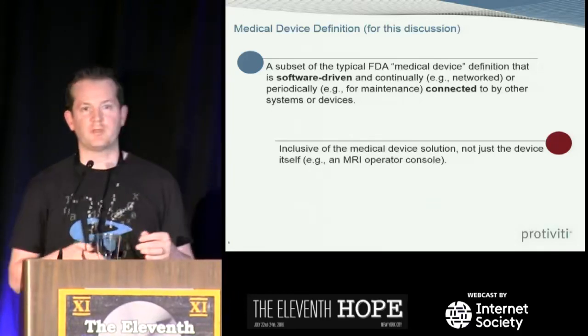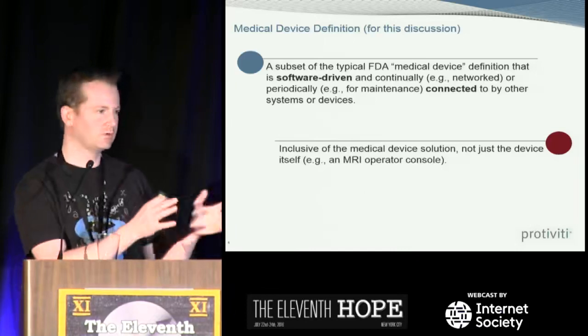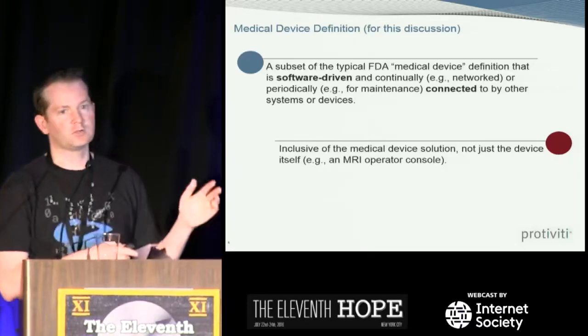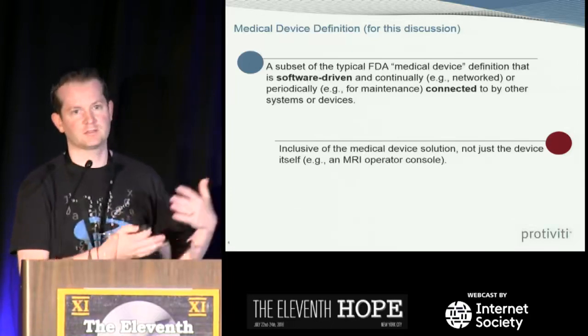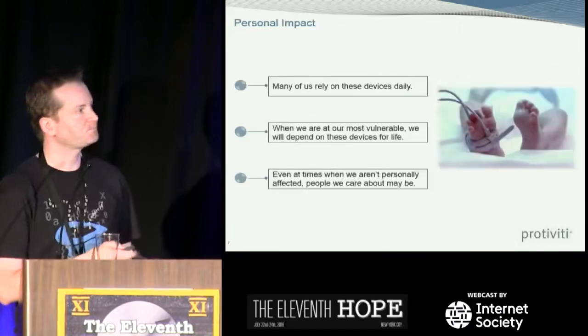And when we talk about the medical device, sometimes you'll think of just the actual physical hardware thing that's maybe running embedded Linux or something like that, or real-time operating system. We're talking about the entire solution. So if there's a device that's controlled by a computer and that's important for the function of that medical device, we include that in this definition.